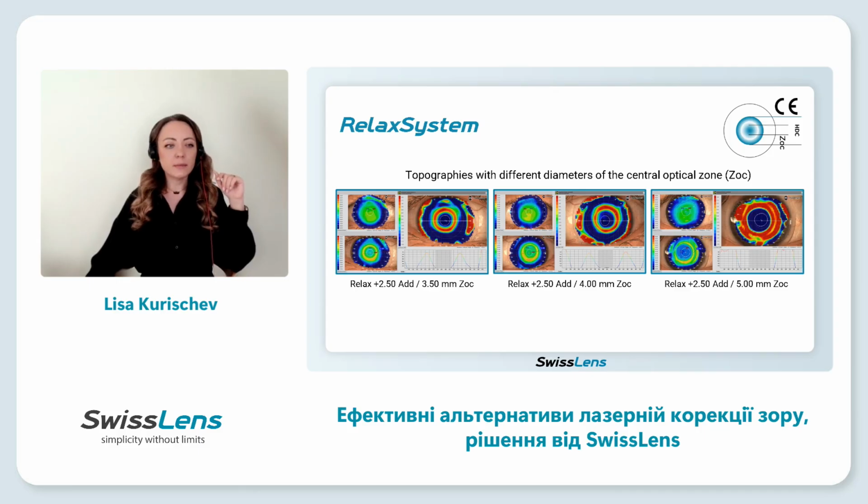What you can see here, for example, on the edge, this is not a topography after ortho-K. We see soft lenses, so it's a topography made with soft lenses. Like this, you can see what kind of optic zone we have. So you can do it 5 millimeter, 4 millimeter, or 3.5 as you want.